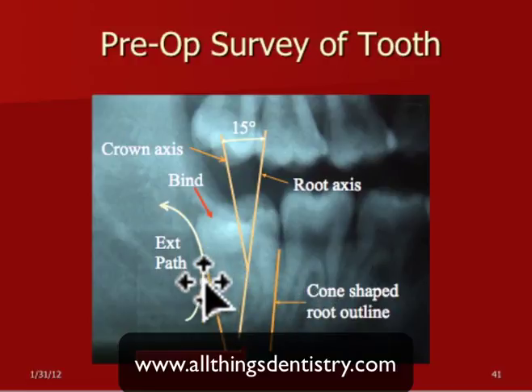The problem we're going to encounter here when this comes out curved, what are you running into? You're running into the little lip of the ramus there. So that's going to bind right there. It's not going to elevate as long as you've got the distal crown pounding against the ramus there. So what are we going to do there?